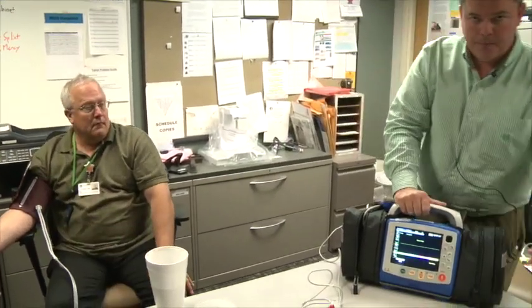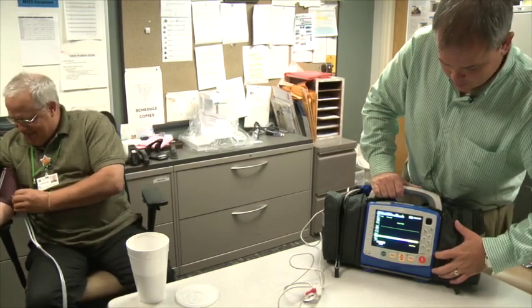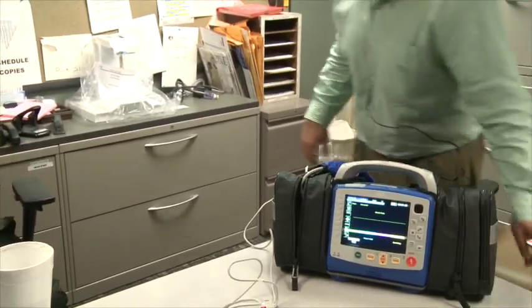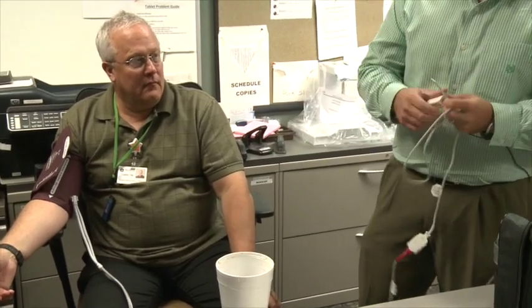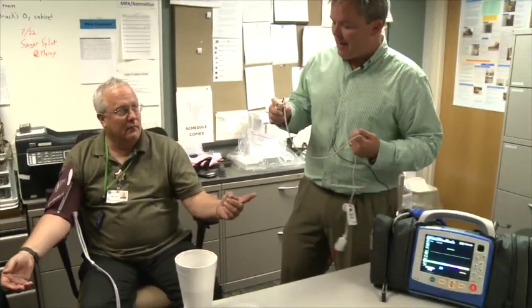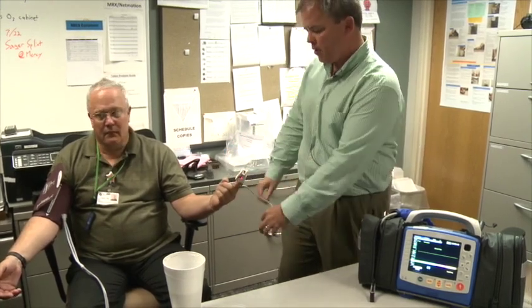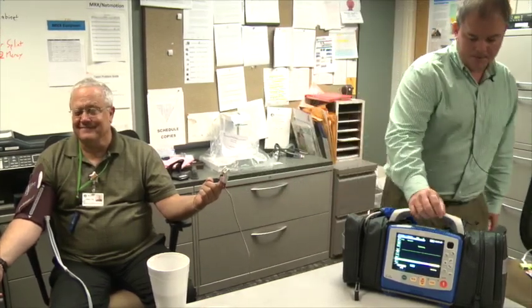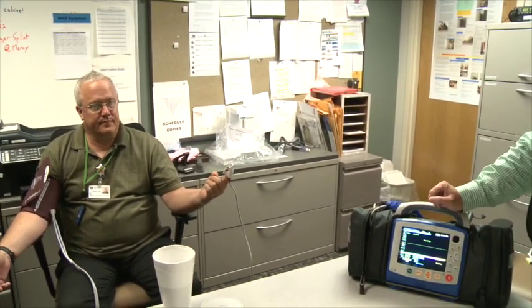To take a blood pressure on the monitor, press the blood pressure button and it will start to count up and take the reading. SpO2 is very simple — the X-Series version is more advanced than previous versions. We do not need to remove fingernail polish or fake or acrylic nails anymore. Put it on the finger and it will give you a reading as well as a heart rate. Note the blood pressure cuff on one arm and the SpO2 on the second arm.